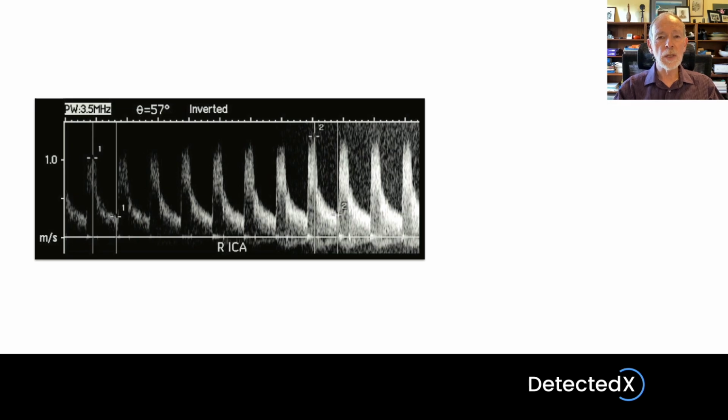The spectrum itself is now nearly white, and we're seeing a lot of background noise caused by electronic noise within the machine. So the gain is definitely too high at this point. So clearly there is an appropriate middle setting or range of settings where the gain is neither too low nor too high.